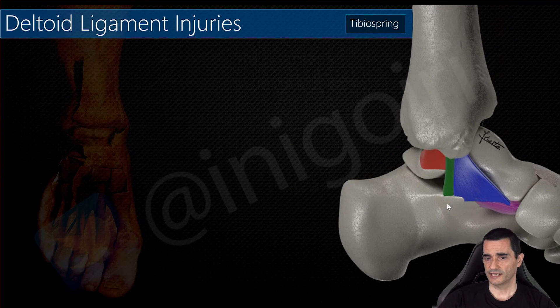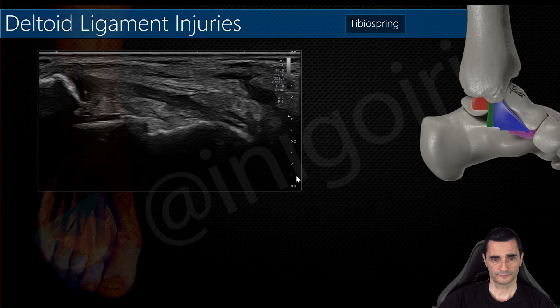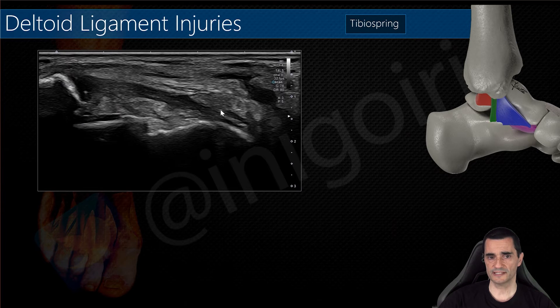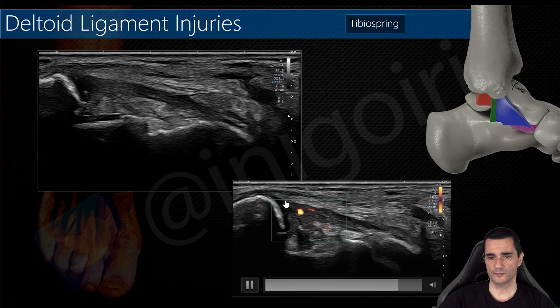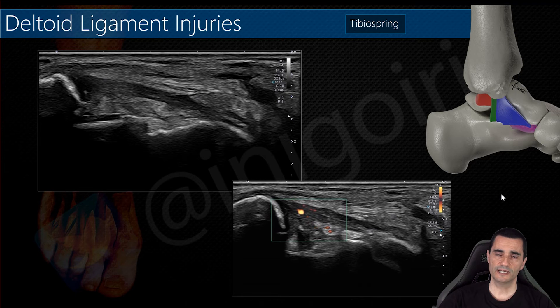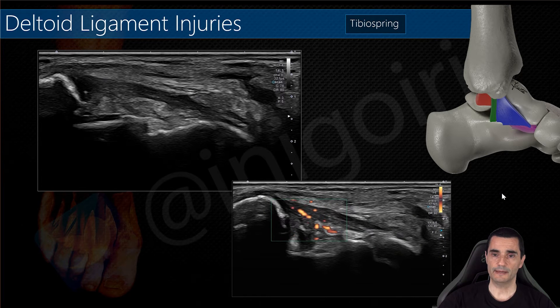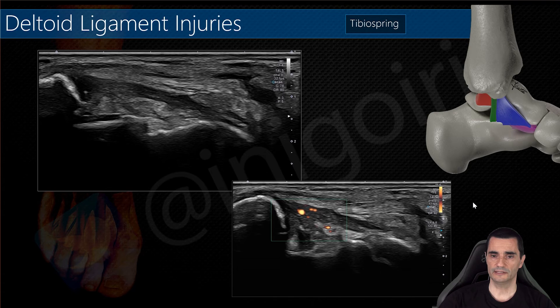Now the tibio-spring component, between the tibia and the spring ligament. This is the tibia, this is the spring ligament on its short axis, and you can notice the thickening and hypoechogenicity of this component. As you can see, we can very accurately name the specific components of the deltoid ligament that are affected.